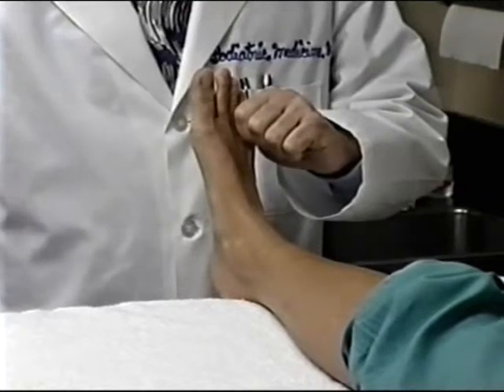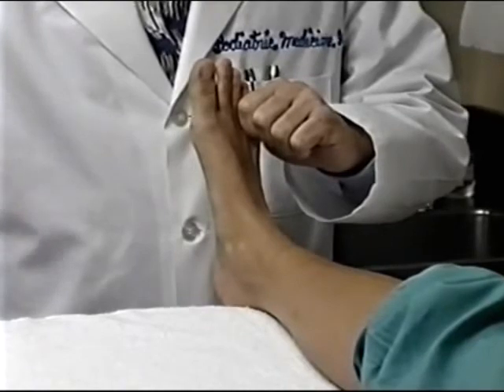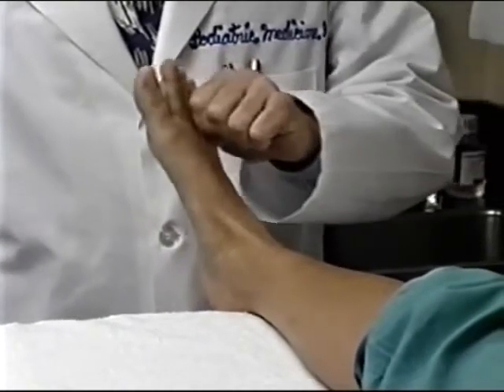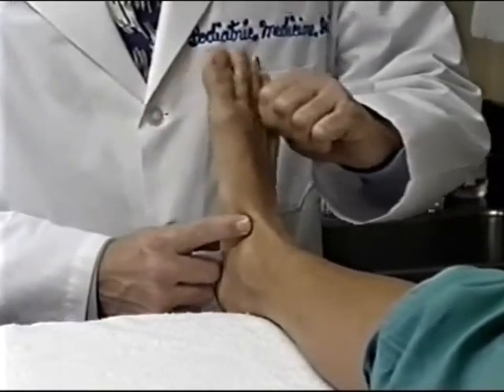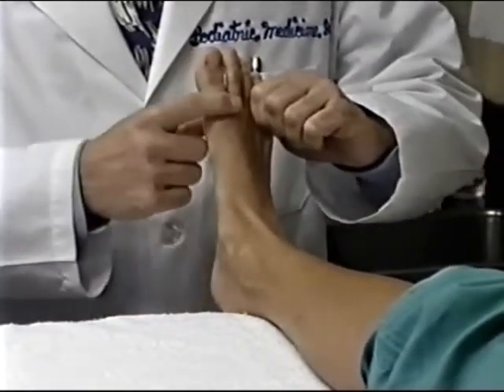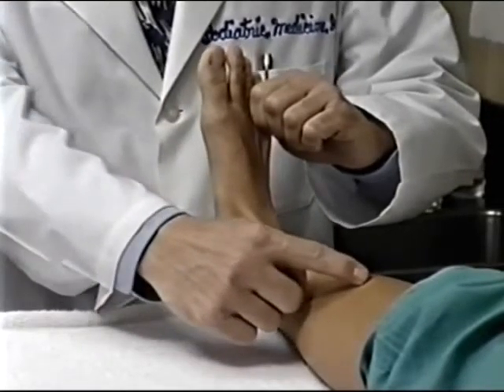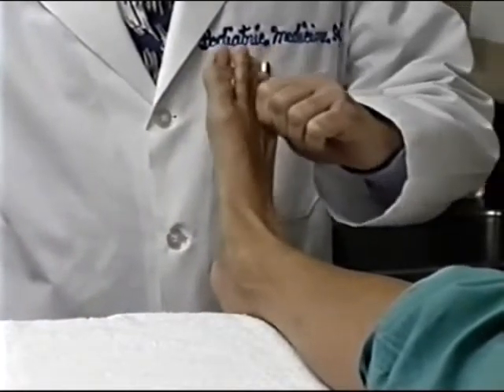There are three objectives in positioning the foot correctly. The first is to place the subtalar joint in its neutral position. You accomplish this by feeling the congruity of the subtalar joint, or by directing the long axis of the second metatarsal with the long axis of the leg. Do not pronate or supinate the foot, but rather keep it in a neutral position.